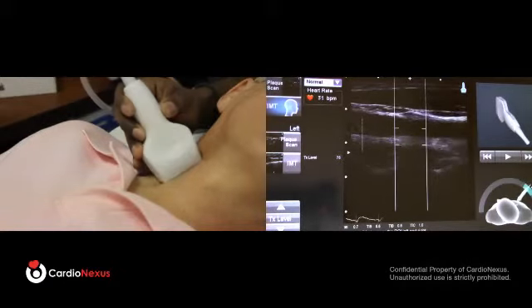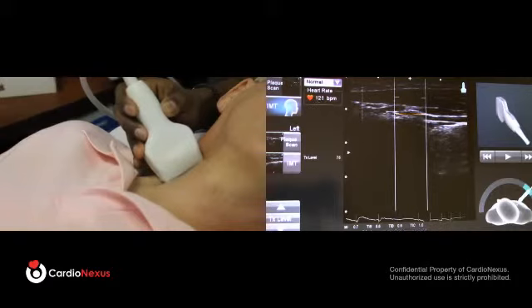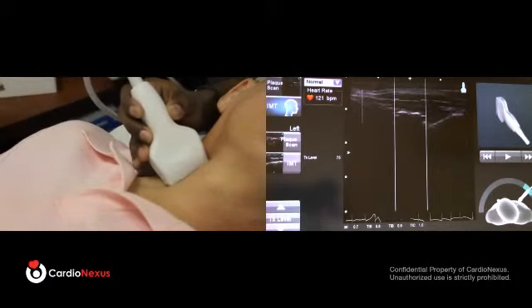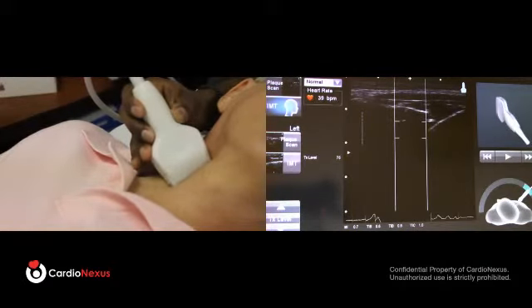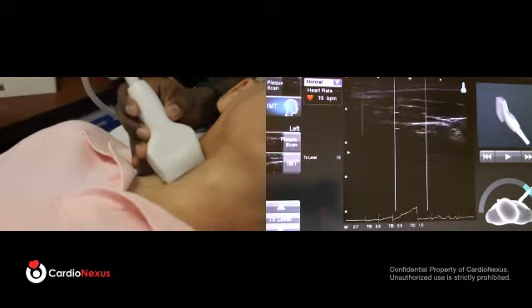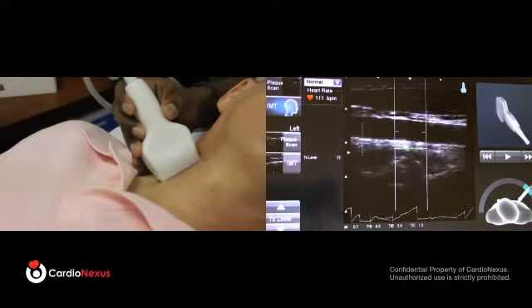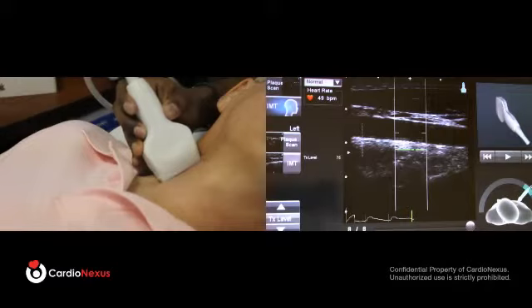I'm going to set my angle. So I'm going to set the angle into the green zone, into the lateral view, and I'm going to find the artery, again, by translating the probe up towards the patient's throat. If you run into the bone, you've gone too far. So just, again, simply pull it back towards the patient's back until you identify a very dark stripe that jumps across the screen. And this is his carotid artery. So it's taken an image.